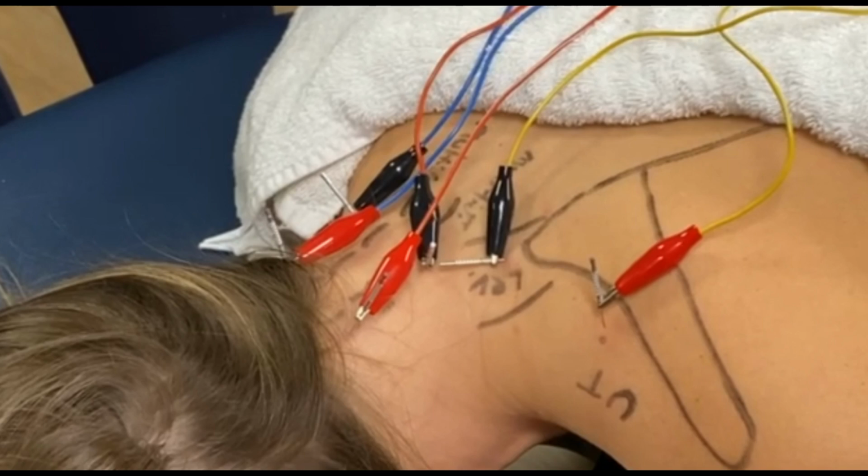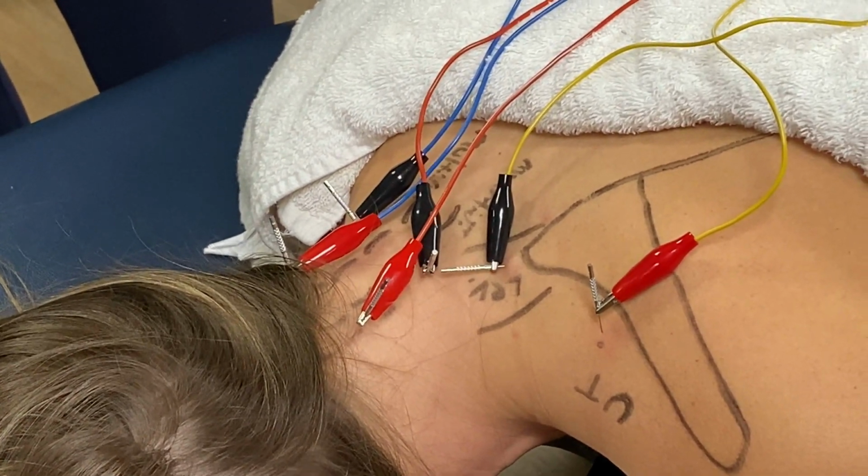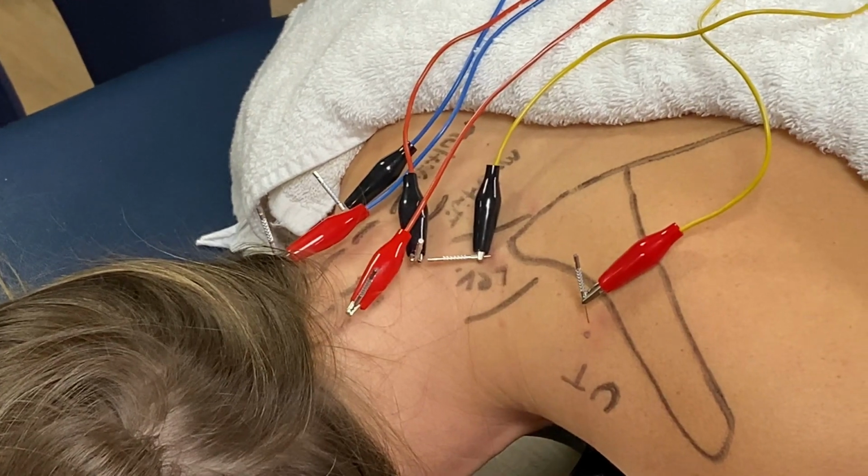And then the last channel, which is the yellow wires in this image, will attach to the levator and the upper trap. For this treatment setup, we typically run the electrical stimulation for 10 to 15 minutes with the intensity set to the patient's tolerance.